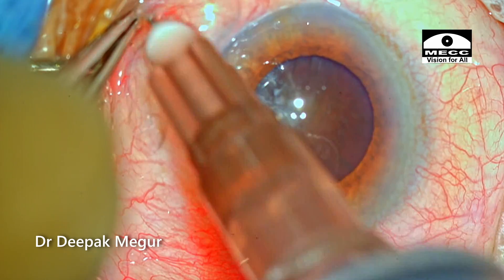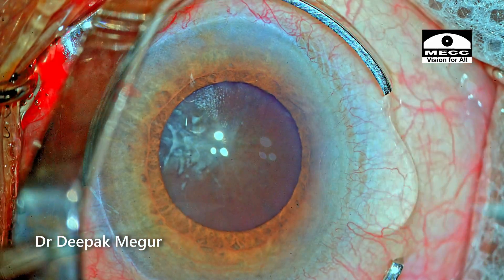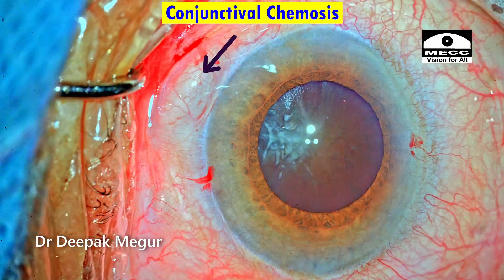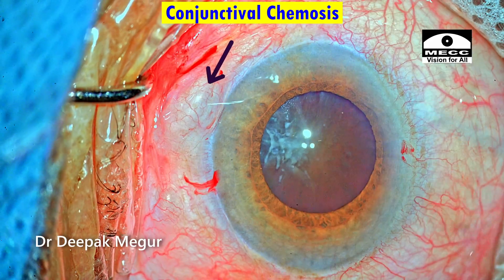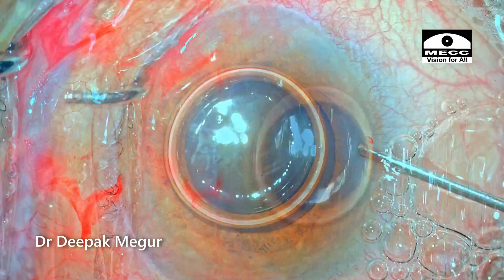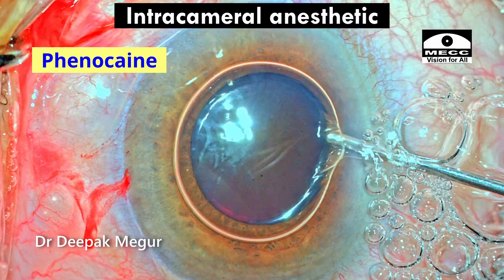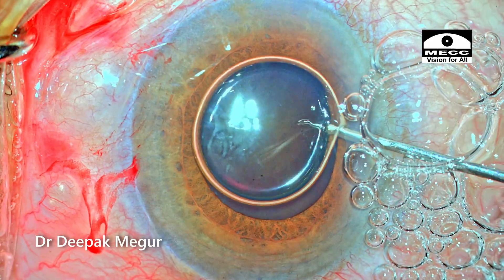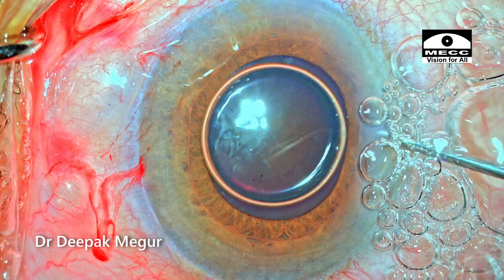This is just to augment the topical anesthesia. The two side ports are being created. There is some amount of conjunctival chemosis, primarily because of the 1 ml of lignocaine given in the sub-Tenon's space. 0.1 ml of intracameral dilating agent along with local anesthetic is used, and I'm hoping that the pupil size improves.